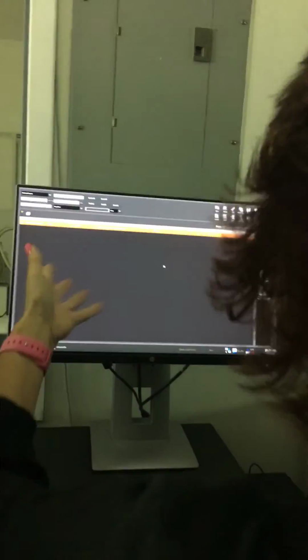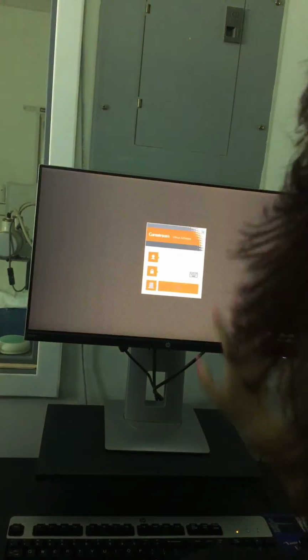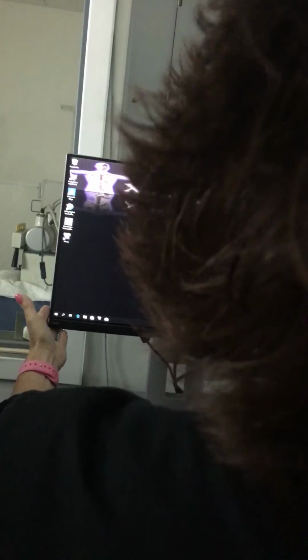It pretty much yells at you for anything you do wrong. It must have sent because it didn't tell me this time, like, hey, you still have unsent images. So I'll go in the class and make sure it sent it to me. That's your control panel for this. And when you shoot, this has to be on and you have to be in that program.